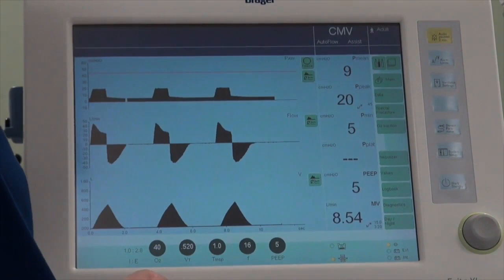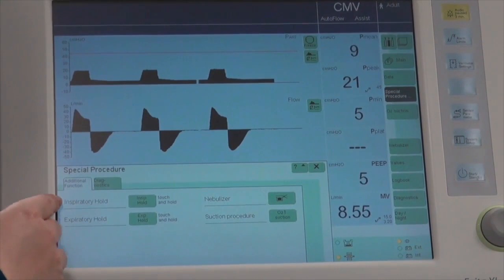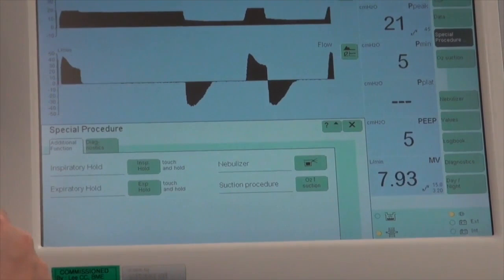To perform the plateau pressure maneuver, go back to the second page where plateau pressure is visible, then go to Special Procedure and look for Inspiratory Hold. Press Inspiratory Hold before the next inspiration and hold the button. You will see a straight line on the pressure-time graph, and the plateau pressure value will appear on screen.